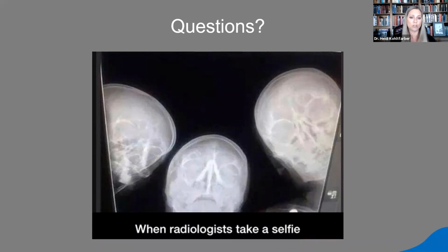Certainly, we see some of this pushed from the legal standpoint as well. But standard of care has to do with a particular diagnostic task. For implants, if something goes wrong and a CBCT wasn't taken, that doctor may not be defendable as far as the malpractice insurance is concerned. So for that particular task, that's pretty much moving towards it. As far as for our airway or our temporomandibular joints, I don't think we're to that point yet.